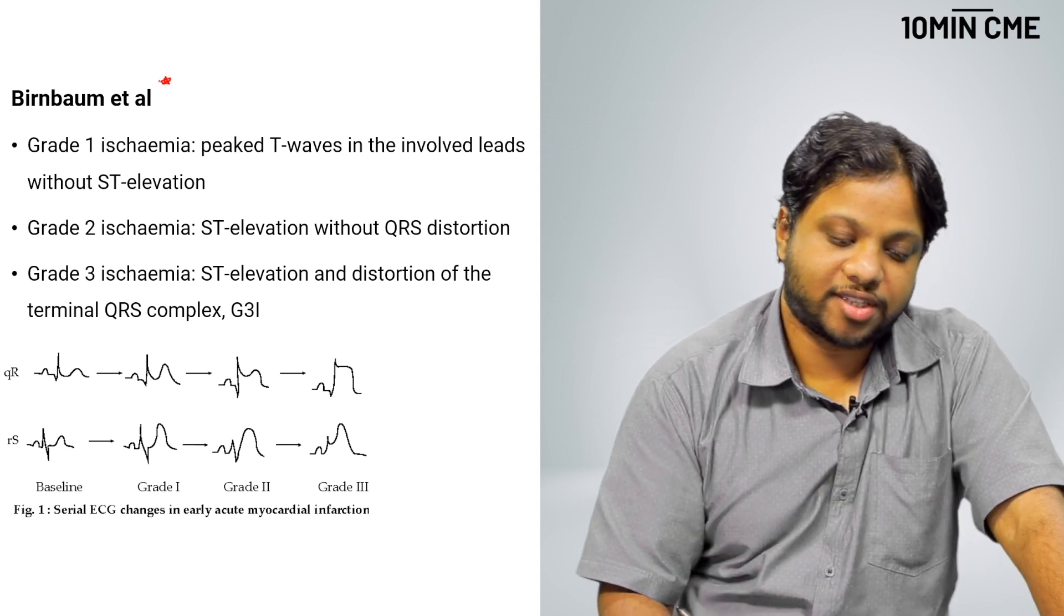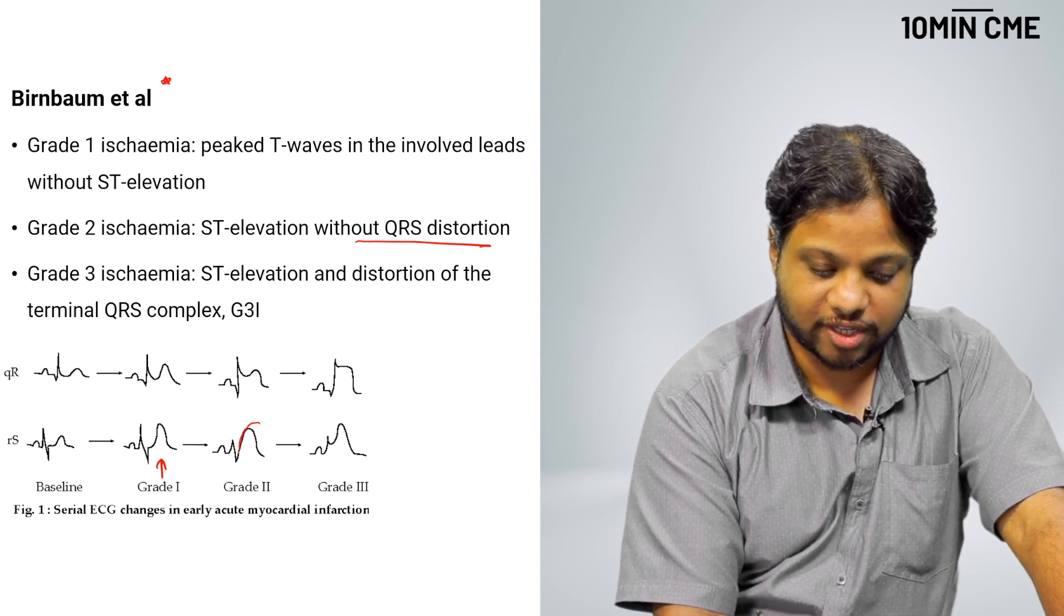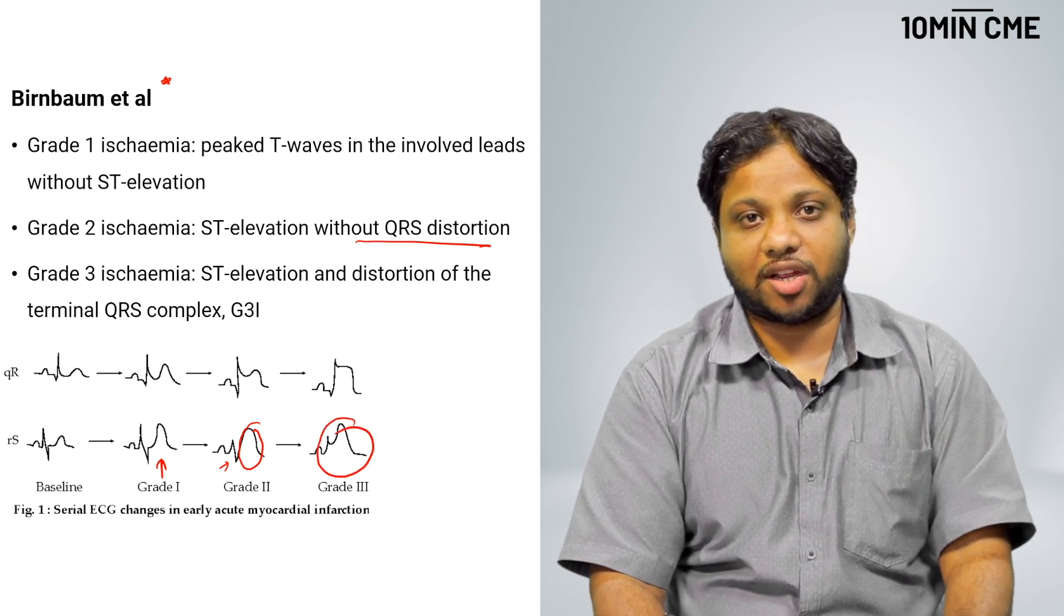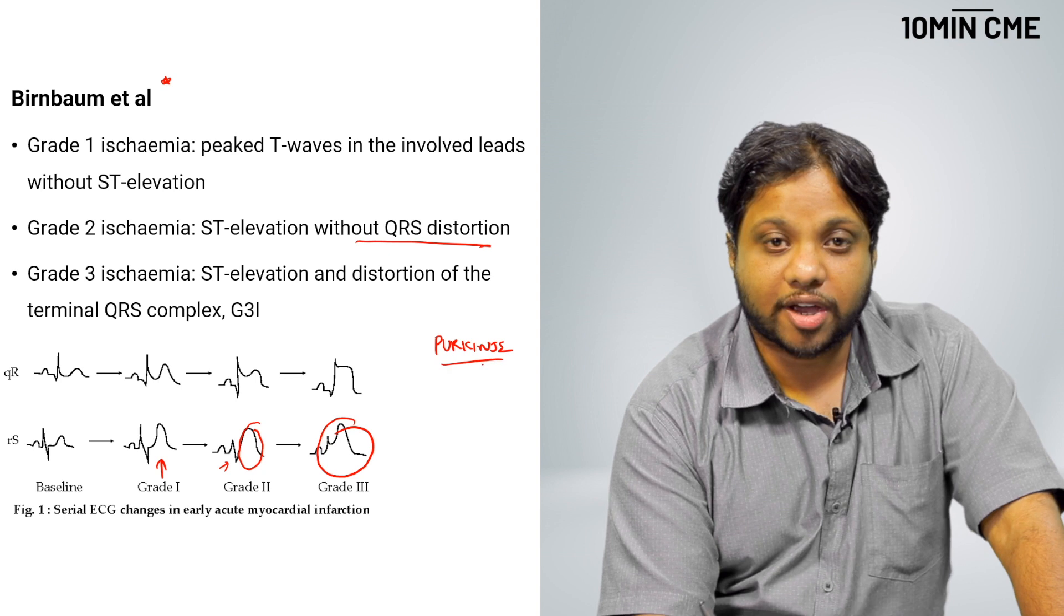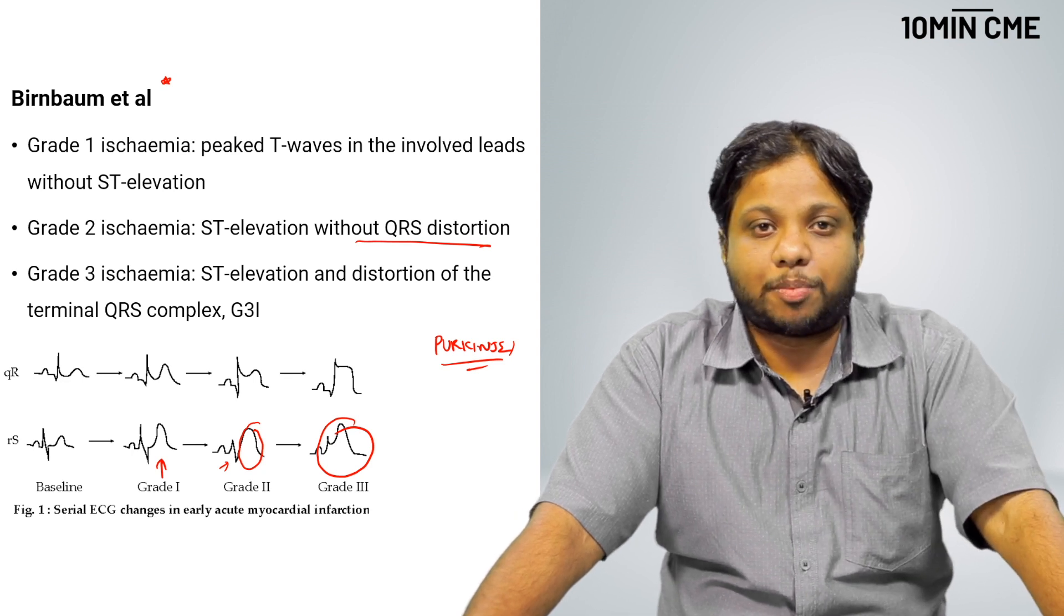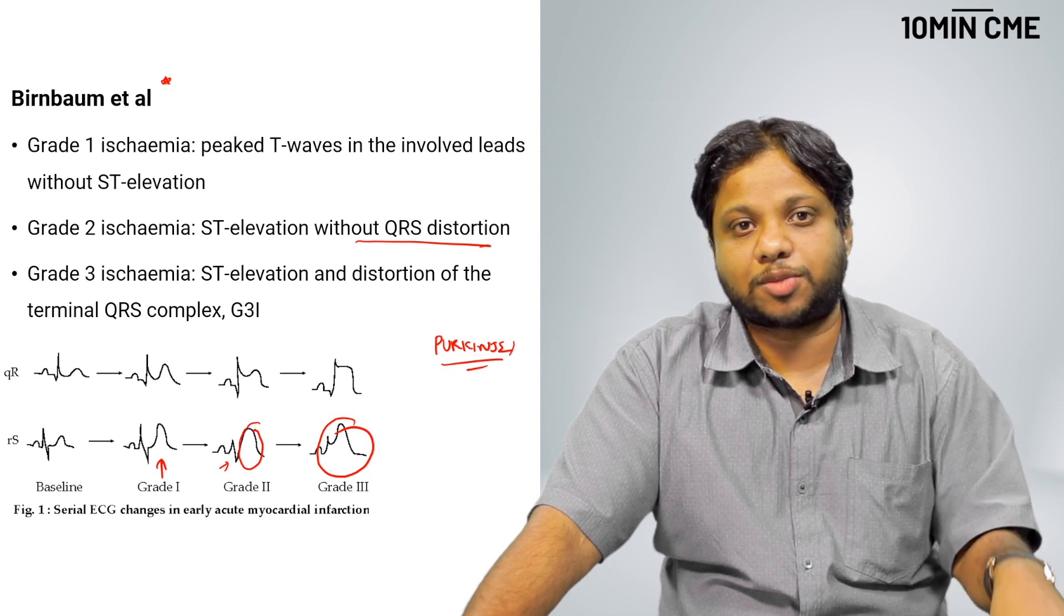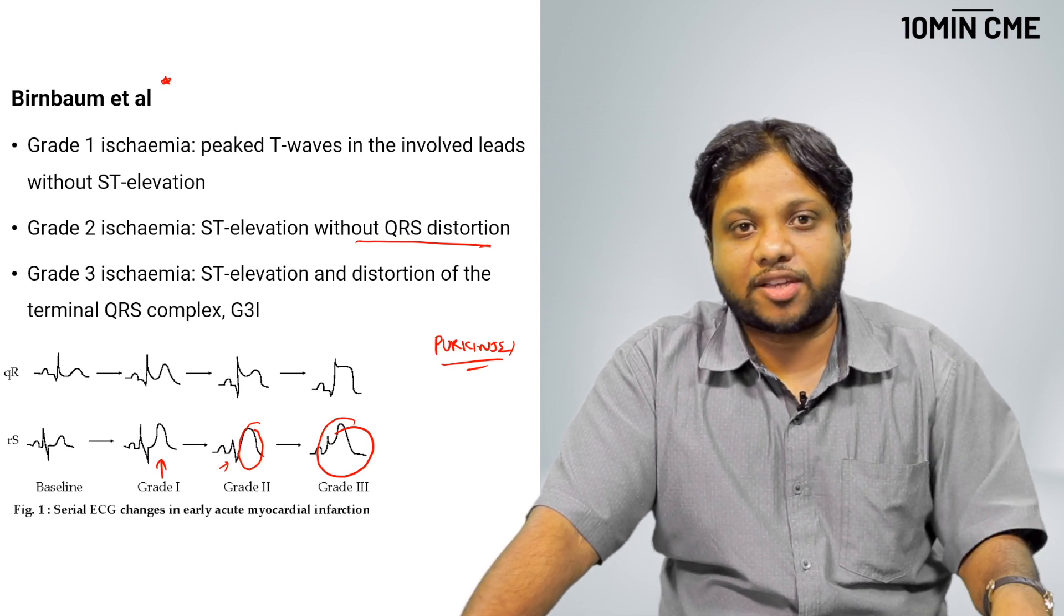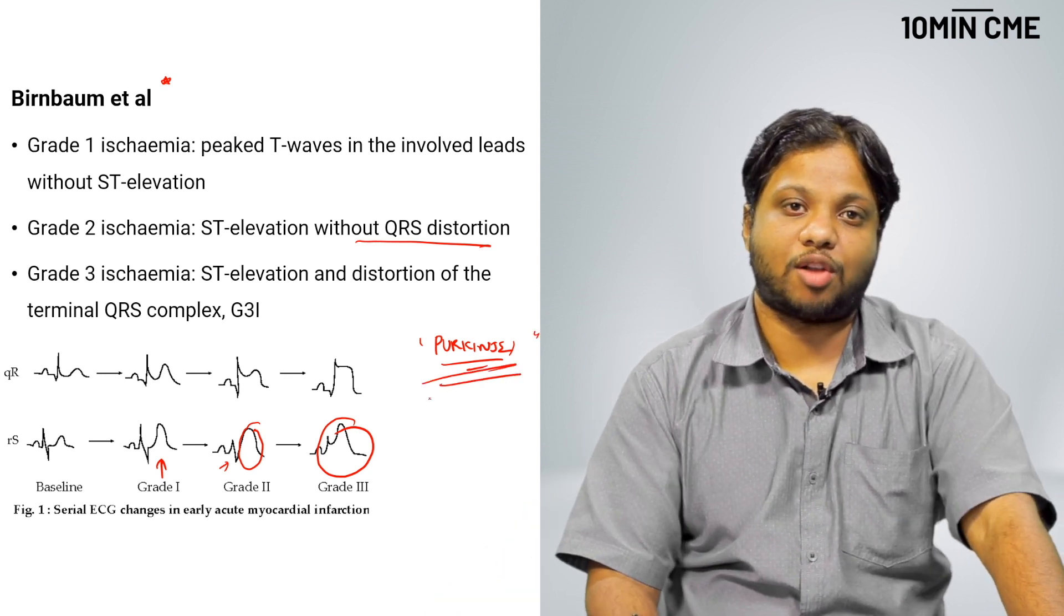This is a classification as per Birnbaum. You can see grade 1 ischemia is just a hyperacute T wave. Grade 2 is ST elevation without QRS distortion. You can see that the QRS is separate. Grade 3 is when it distorts the QRS complex as in our case. Whenever you see a grade 3 ischemia, it automatically indicates involvement of the Purkinje fibers. Now, your Purkinje fibers are the most resistant area to ischemia. Involvement of that signifies marked ischemia. The patient obviously is going to be sicker and what is more important is this patient might not have a very good response to primary PCI or thrombolytics. Grade 3 ischemia indicates Purkinje fiber involvement, a bad prognosis.